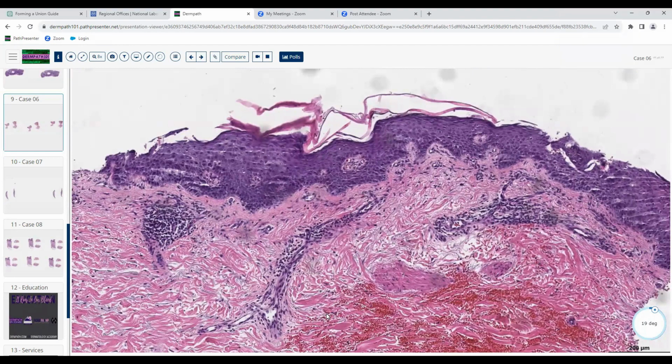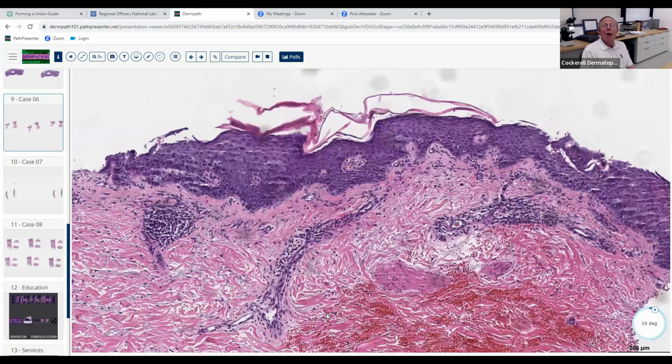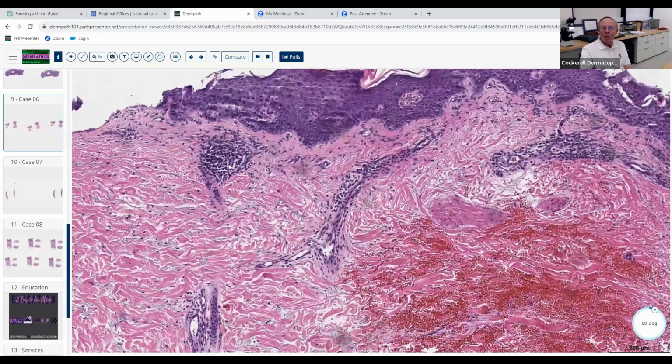When I think about perivascular inflammation, mostly lymphocytes, the L's come to mind. Good, the 5 Ls. Now, this doesn't have the deep infiltrate, but anytime you get any of those superficial and deep infiltrates, sometimes they can be only superficial also. So I would agree, you'd put those 5 Ls in the differential diagnosis. Now, which of those do you like the best here, since there's no mucin, there's not much epidermal involvement, maybe there's a couple of dyskeratotic keratinocytes?